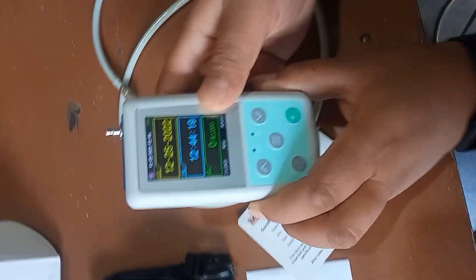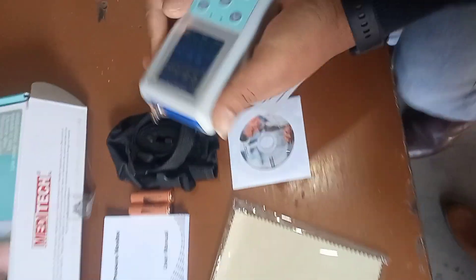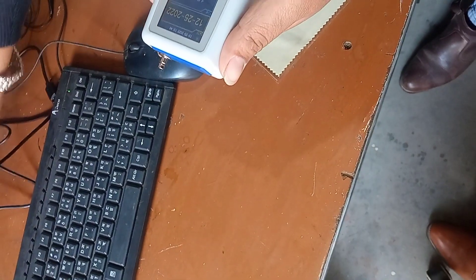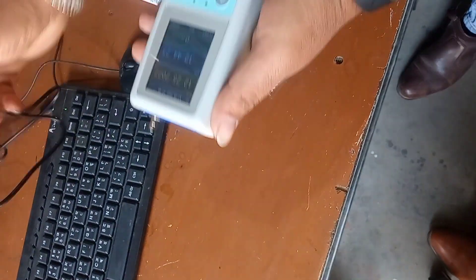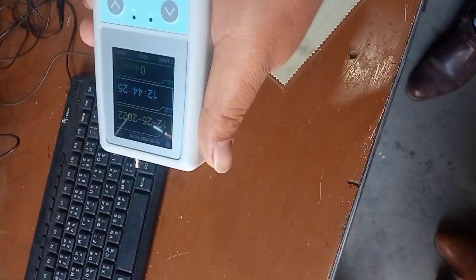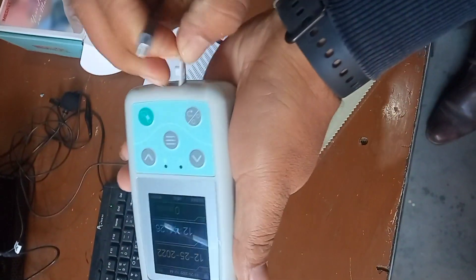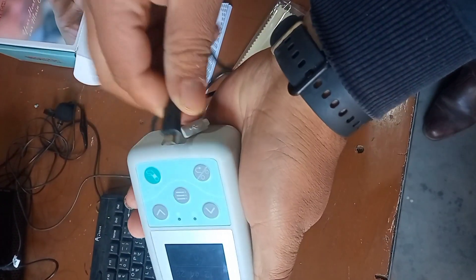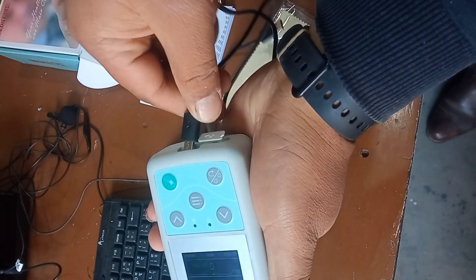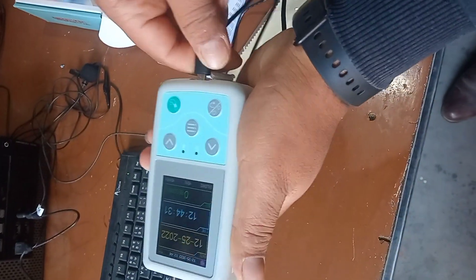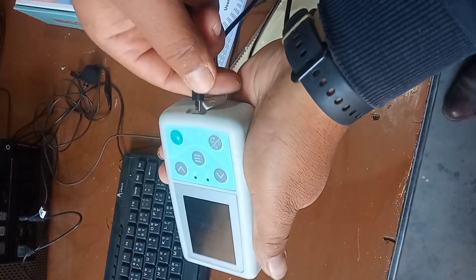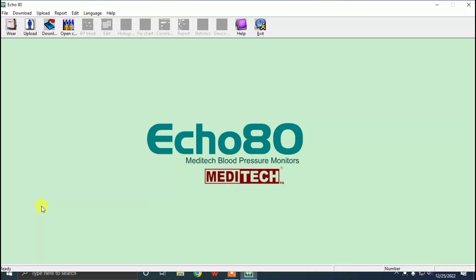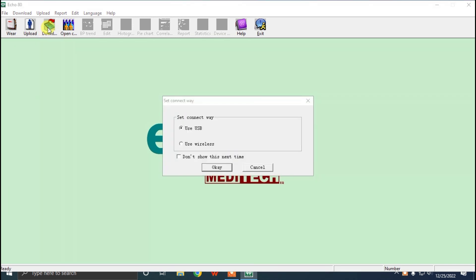After connecting, we can download the patient data. For that, click download. After that, you will get like this, and as it is USB, it's OK. Finish download, OK.